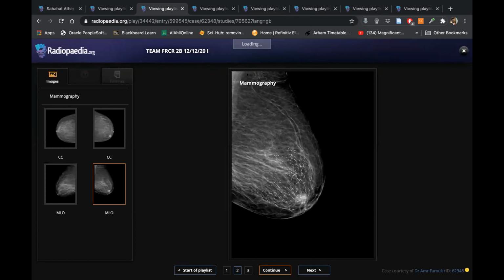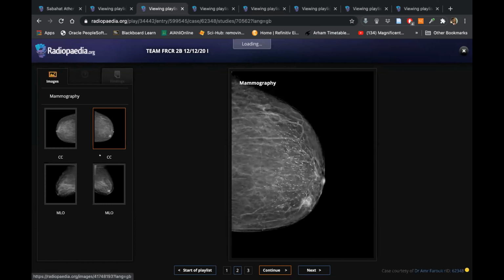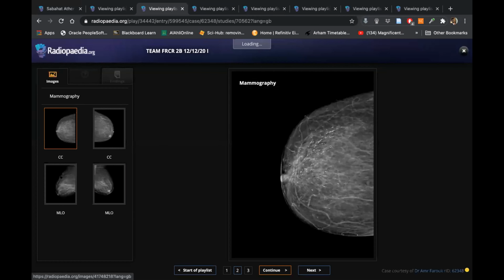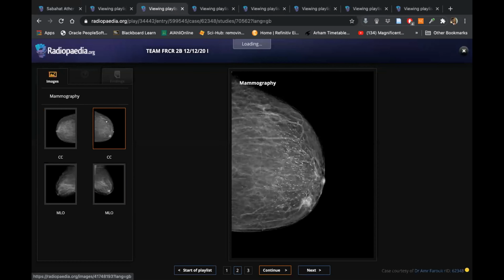Honestly, I also forget every time. Multifocality is the lesion in the same quadrant. Okay. Like this is the lower inner quadrant. In the same quadrant or within 4 centimeters of the primary lesion. Okay, this I'm telling you from Rapid Review of Radiology, Shahid Hussain. Okay. And multicentricity is when it is in another quadrant, or more than 4 cm, or in the contralateral breast, as you said. Okay. So focal is in the same, near, and centric is other quadrant. Okay. Otherwise, this was perfect.